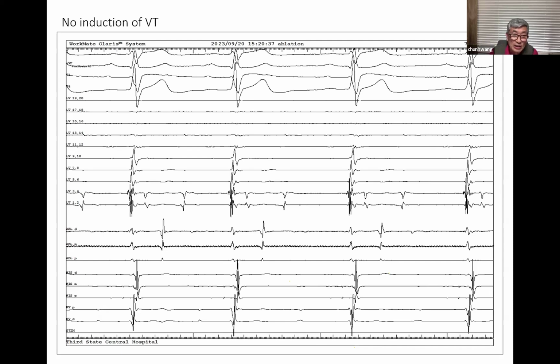recommendation, especially for 2D era countries, Mongolia, Cambodia, Myanmar, okay? And take LAO, RAO views, and LV angiography. So that way you will know. And then I think your approach is correct also. You do one mapping catheter transaortic, the second one transeptal, okay? That's a good way. You teach us.